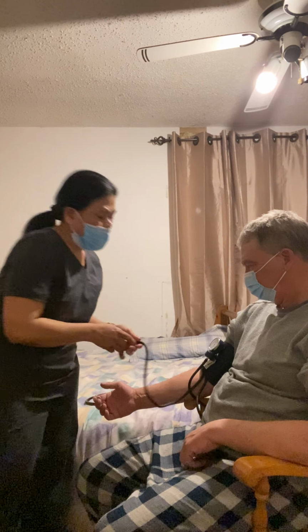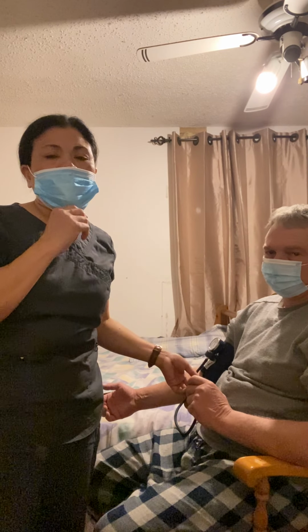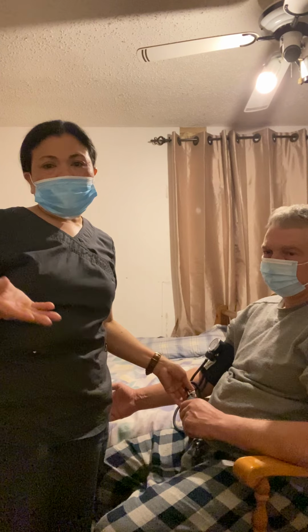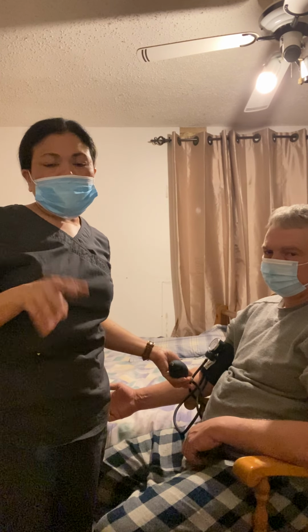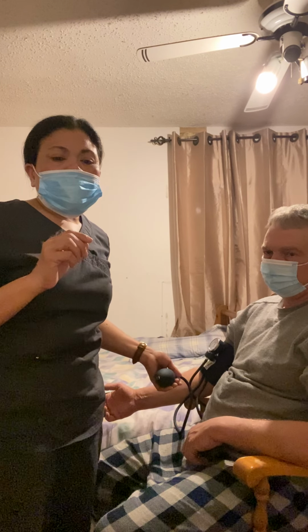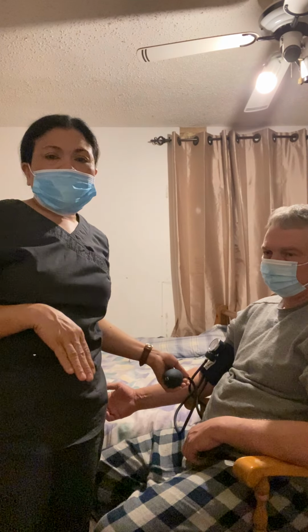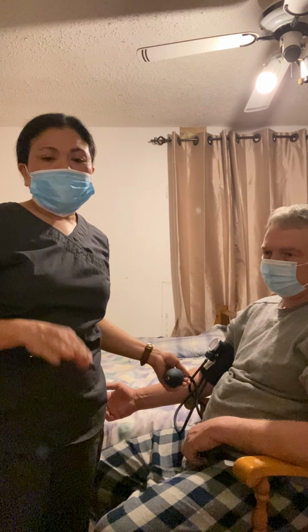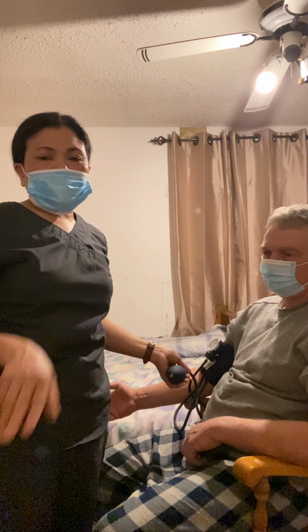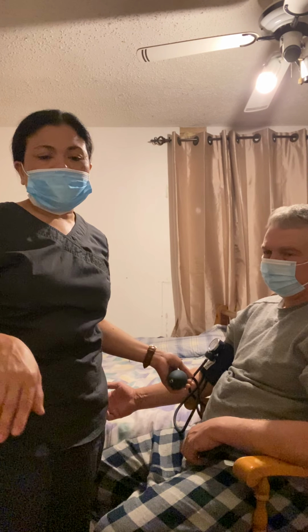Okay, so the patient's blood pressure is 118/62, where 118 is the systolic number and 62 is the diastolic number. The normal pressure for the systolic is 110 to 119, and the diastolic normal pressure is 60 to 79.